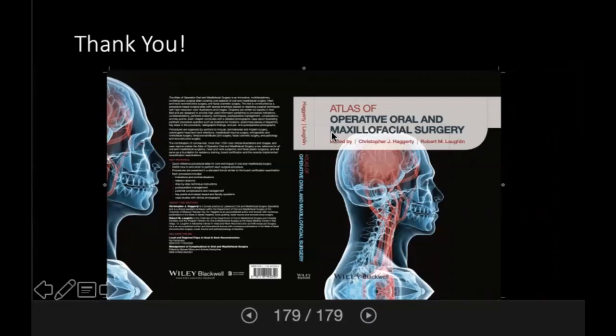And kind of as we discussed briefly earlier, you do get considerable support to the prosthesis, not only from the implants, but also from the palatal acrylic. So I always like to have a palate when I can. Every now and then you have that patient that just doesn't want a palate. And again, if they want a palateless prosthesis, you're probably going to need to either place 6 implants or place a bar.